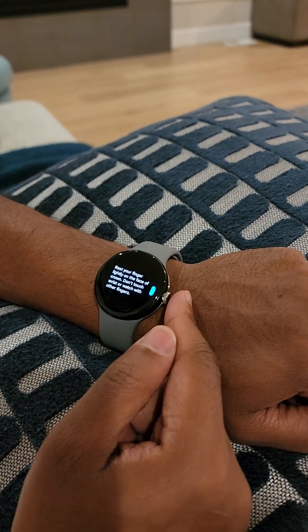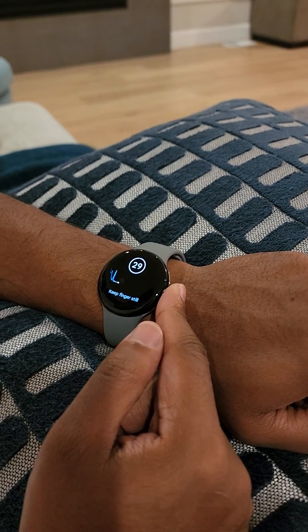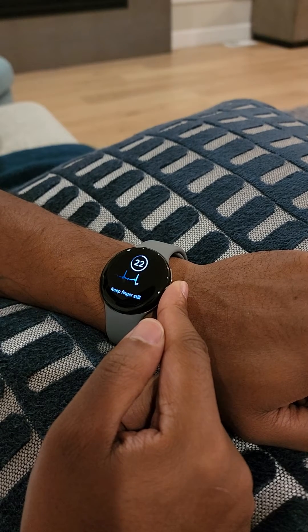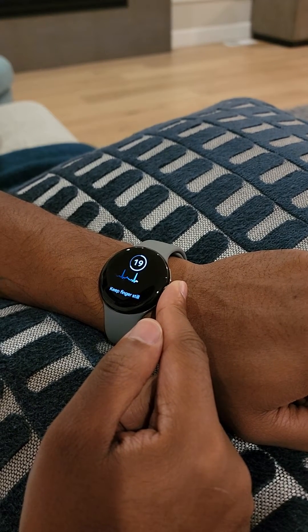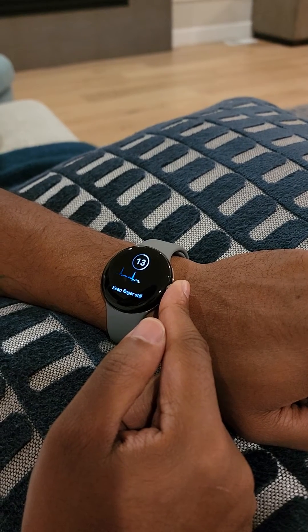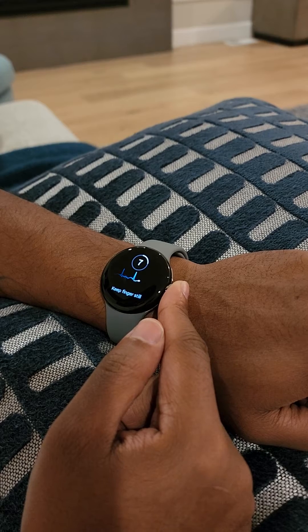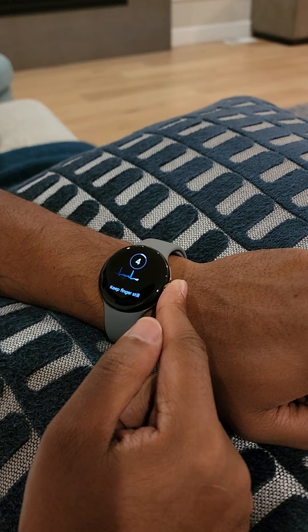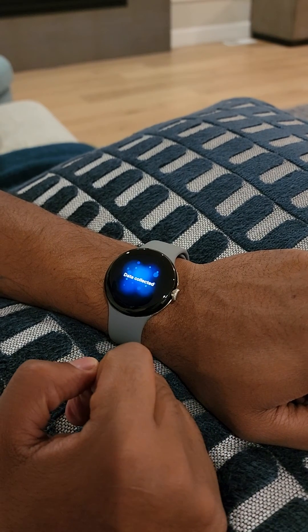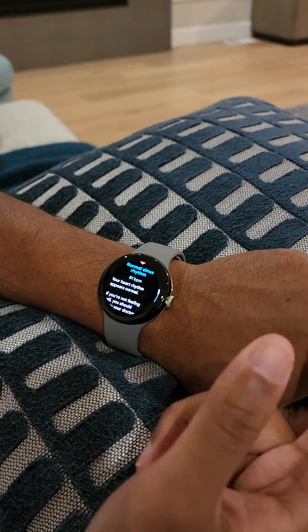You just rest your finger on the crown. It collects the data and it comes back with the results. So it totally works.